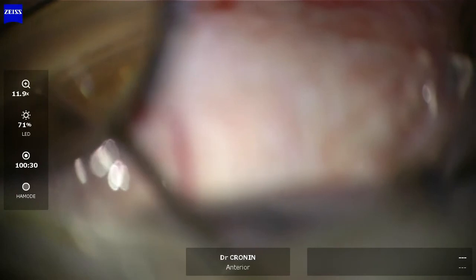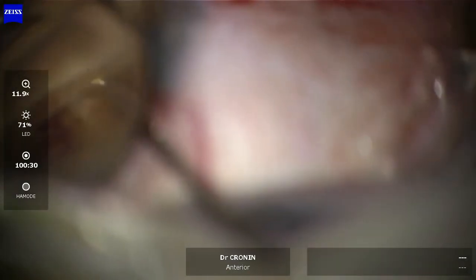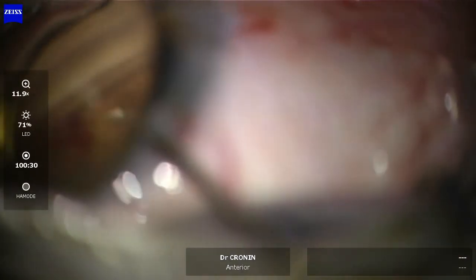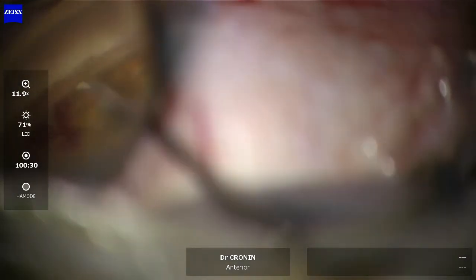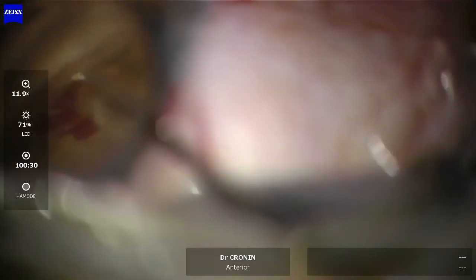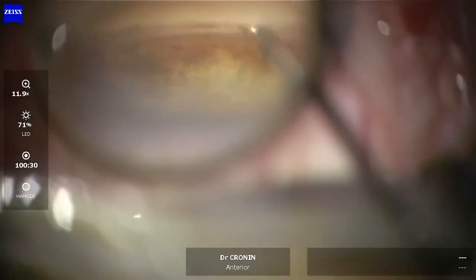Again, just make sure you remove all of that trabecular meshwork. It's not just an incision, you're actually removing that meshwork, which you can see me doing there with the needle. That's a key to the success of the procedure. It's very quick, very safe, very easy, and very effective for patients, essentially with no additional cost to the patient or the operating theatre.